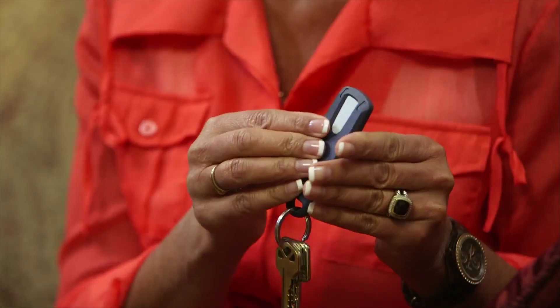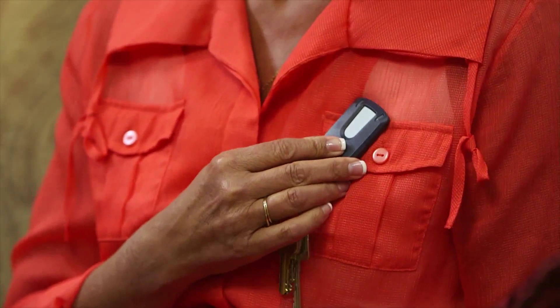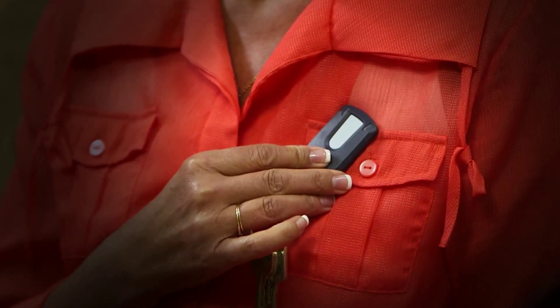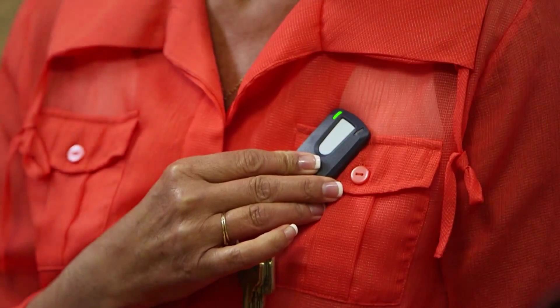Using the patient assistant is simple. When you experience a symptom, press and release the button. The searching light will start to flash blue. Next, hold the patient assistant flat against your chest directly over your RevealLink ICM. When a symptom is successfully marked, a tone will sound and the success light will illuminate green. If these signals don't occur within 15 seconds, repeat the process.